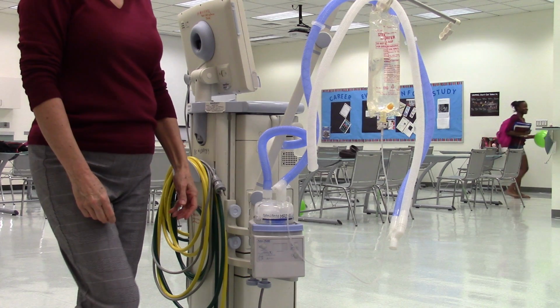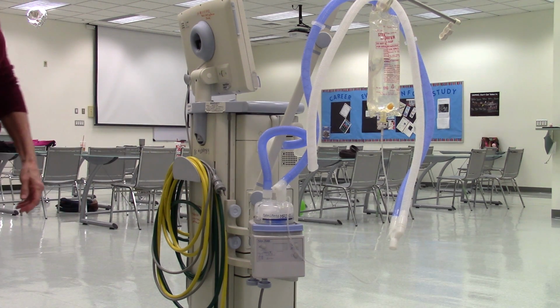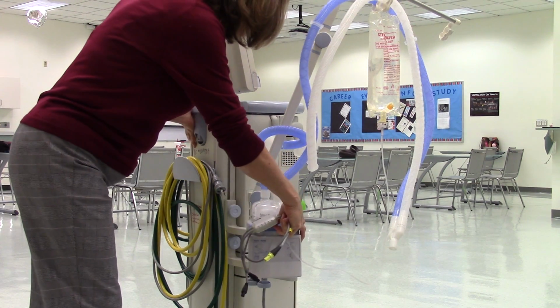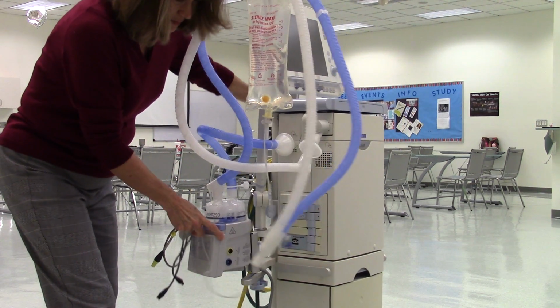Okay. So it says, you are now ready to connect the temperature probes and sensors and the heater wires. They are coded by size and color to prevent the wrong connection from occurring. First, connect the blue and yellow connectors to the side of the humidifier.